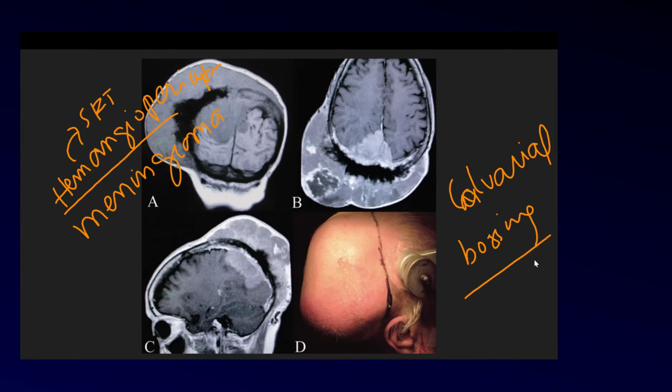Okay. I think hemangiopericytoma is a differential for meningioma, and hemangiopericytoma tumors are, I think, more vascular as compared to meningiomas. No, I was asking about the radiological differences. If you get a certain image, how would you decide whether this is meningioma or more likely hemangiopericytoma?